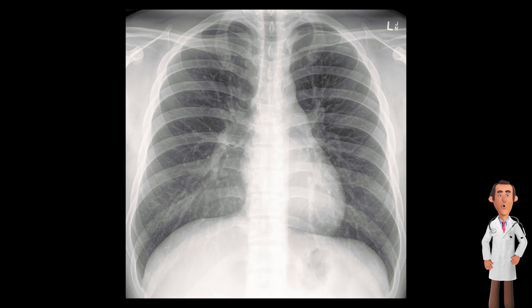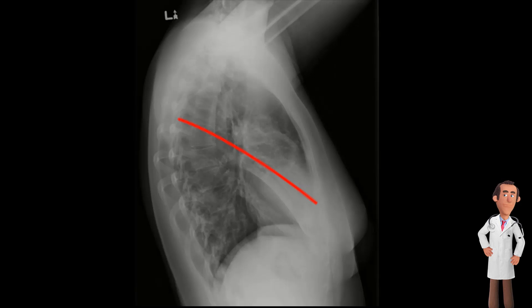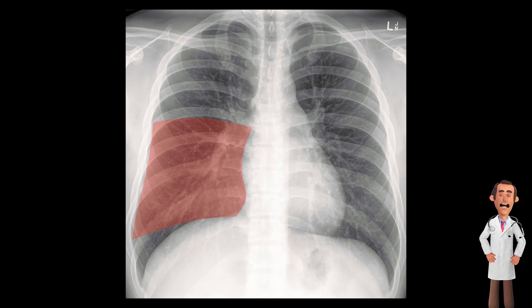Moving on to the lung fields, we will start with the lobes. The right lung is divided into three distinct lobes by the horizontal fissure and the oblique fissure. The right upper lobe is highlighted here. Then we see the right middle lobe, which overlaps with the right heart border, and the right lower lobe, which touches the right hemidiaphragm.